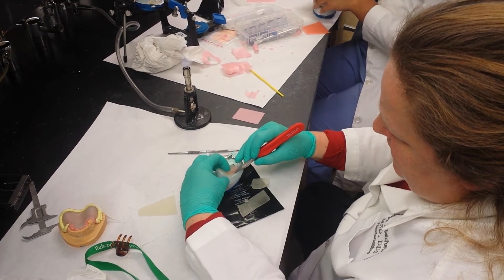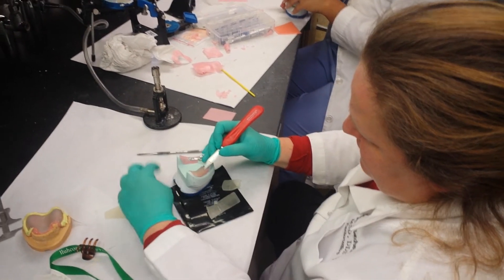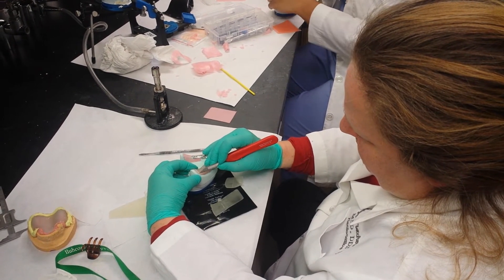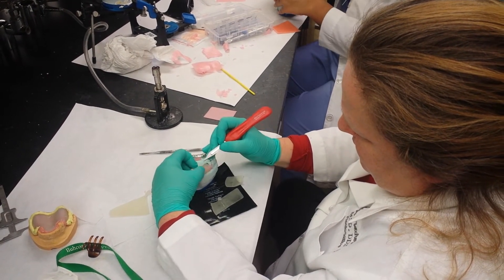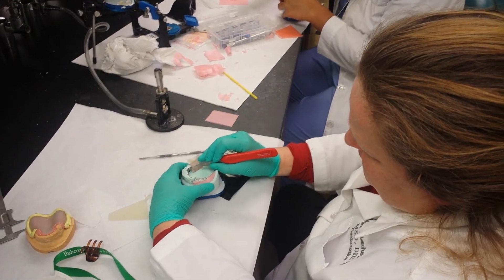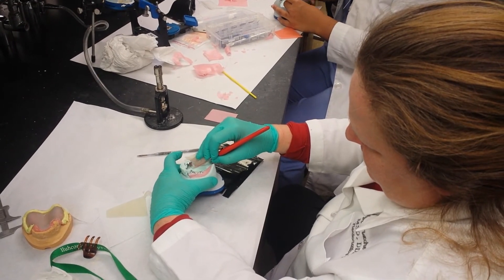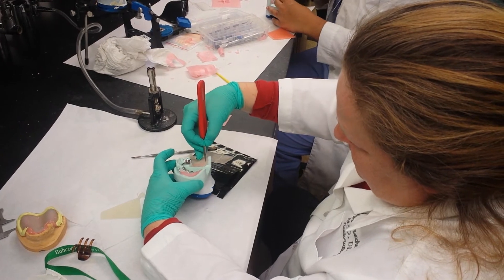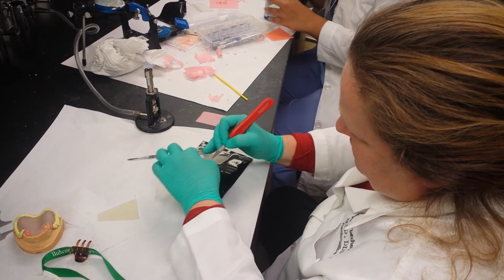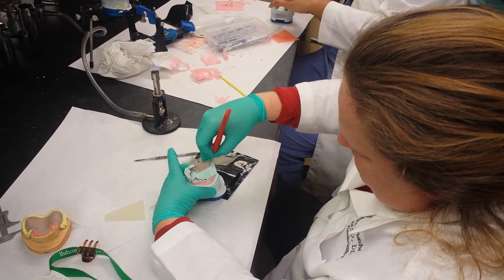I'll try this back on and make sure it's shy of the vestibule everywhere after it's been cured. But I'll give myself a start here by cutting this away. The shape of the wax doesn't matter so much — the shape of the tray needs to be two millimeters shy of the vestibule so I'll have room for border molding in the patient's mouth.